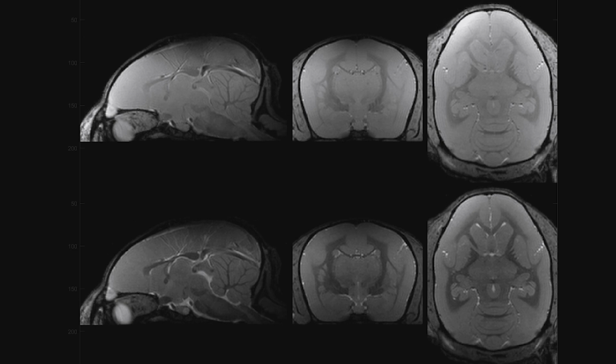And the point I want to make about this is, again, that when we think of translational imaging, often we want to do the same thing. So we take our human sequences and we put them in mice and we run the same thing because that's translational. Actually, that's a fallacious position because the scales are so different, the parameters are different. To make it translational, what you want to do is, at every scale you have, acquire the best images you can, and that's to optimize for the contrast that you've got, optimize for the difference in magnetization properties that you've got.